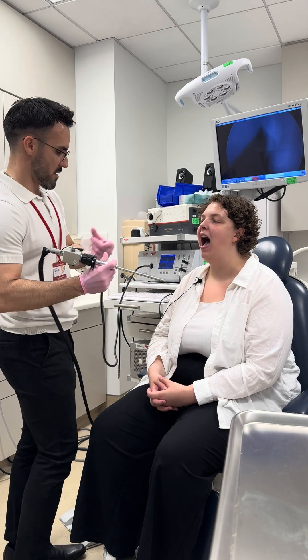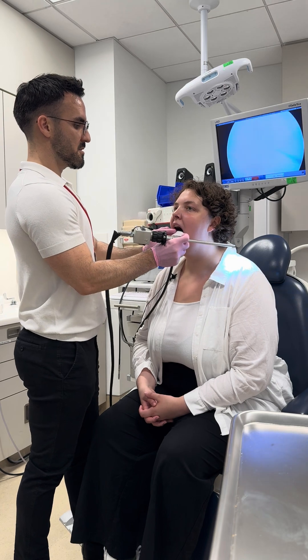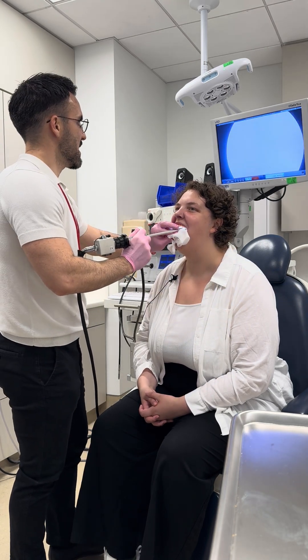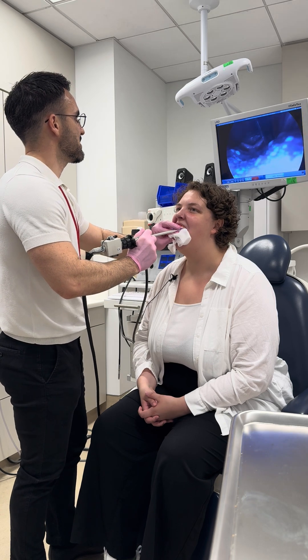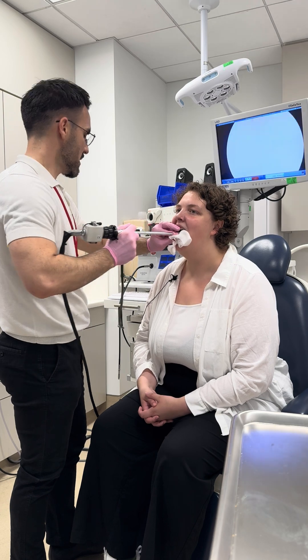All right. Go ahead and lean forward, chin up, tongue out. Tongue out even further. There you go. Excellent. Good. Gently bite down. Good. Smile and say eeeee. Good, all right.